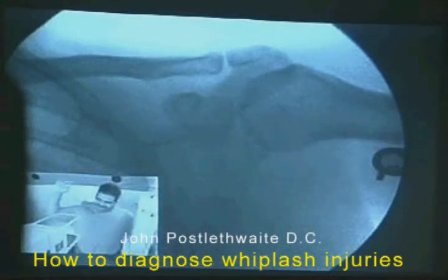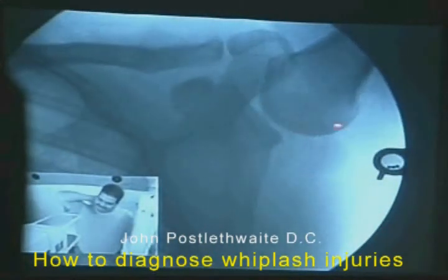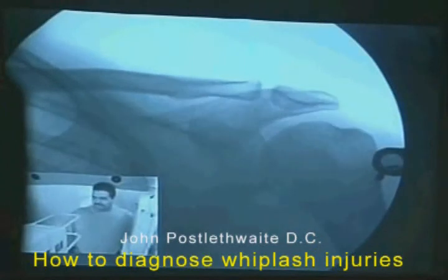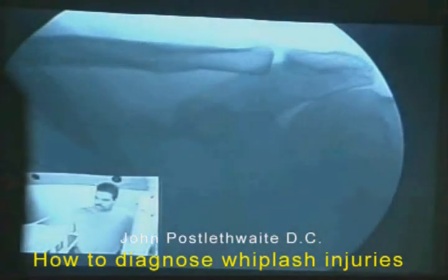So I go to Jose, I go, I'm no rocket scientist again, but how does it hurt? Because I keep telling all you doctors, when I lift my arm above my head, my shoulder pops out of place. So I said, well, I'll tell you what, I'm the guy listening to you. Lift your arm above your head, watch it pull out of place. There it goes. So I went to the orthopedic surgeon, I go, there's your problem, you never asked him to move. See, technology has advanced so much that this makes treating patients easy because we can see.